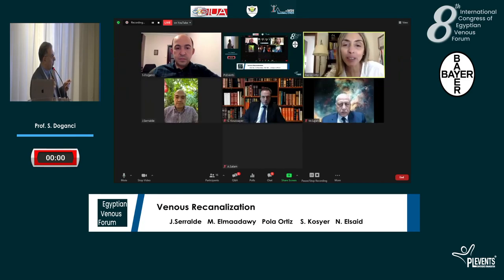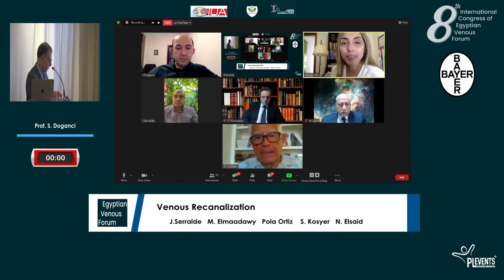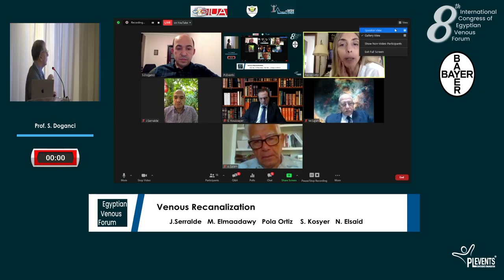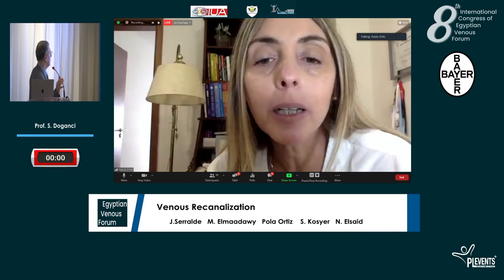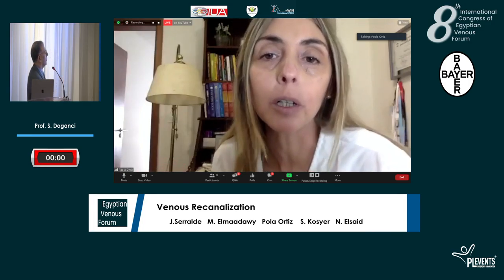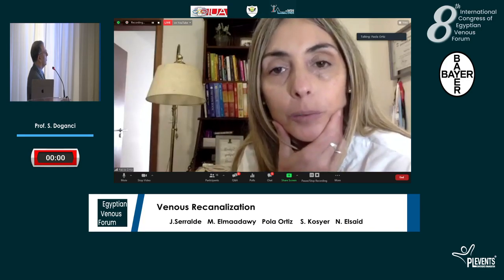Thank you for the invitation and the opportunity to participate. An excellent presentation, Dr. Dognazzi. I have a question for you regarding age. Is it a limitation for you when it is a young woman who wants to get pregnant, for the indication of treatment, or also for the type of stent that you would place in a woman who wants to be pregnant in the future?